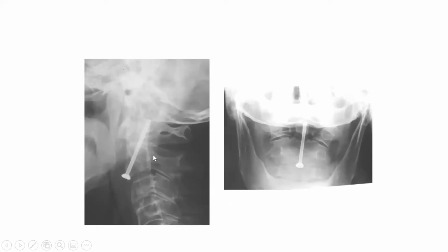So this is a typical, well-fixed peg. It doesn't look like it, but it is. You can see a couple of problems. First of all, with the screw, you tend to violate the C2-3 disc space to get the access. And sometimes the screw breaks out here, so you get early breakout. The screw looks like it's gone to the back of the peg. Maybe your cord is running between there and there. That's where you don't want to go.